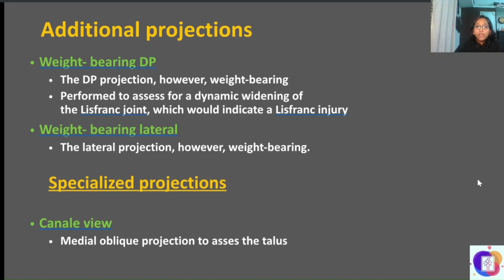Next, we have weight bearing lateral. So same lateral view you're taking, but with a stress, with weight bearing. So lateral projection, but however weight bearing. In this, it's difficult to take a weight bearing, that is patient can't bear the weight. So physically the stress is given by the technician at the base of the foot in lateral view, and then the X-ray is taken.